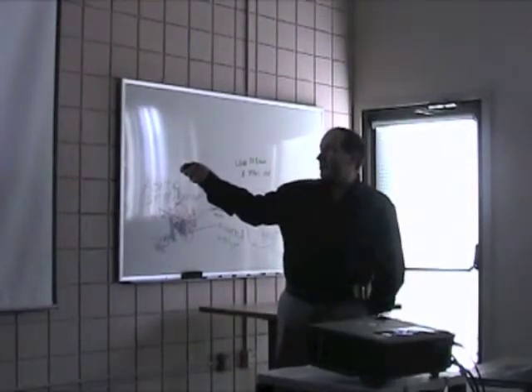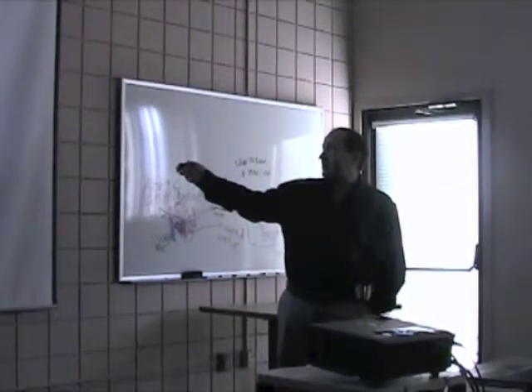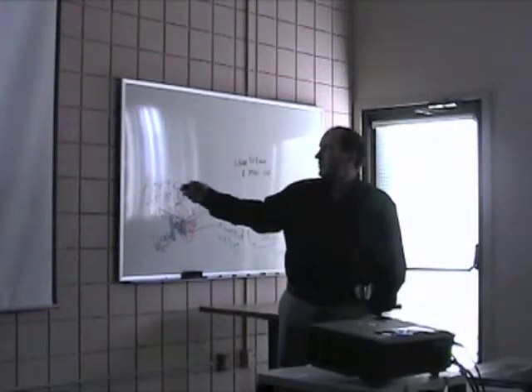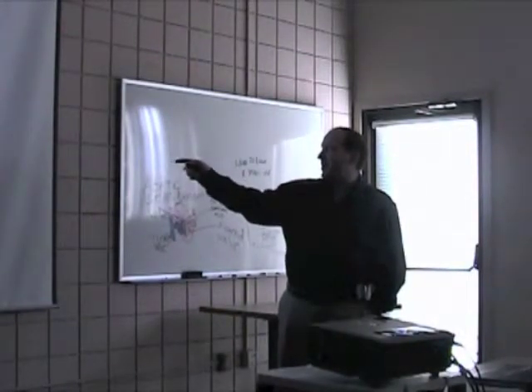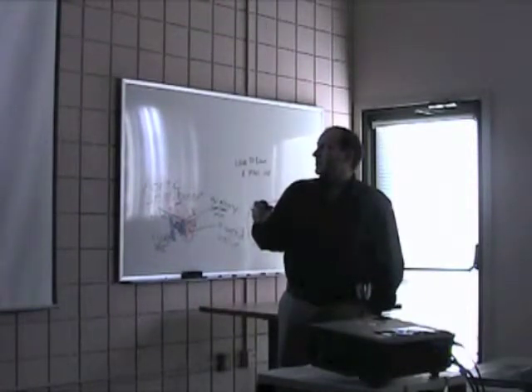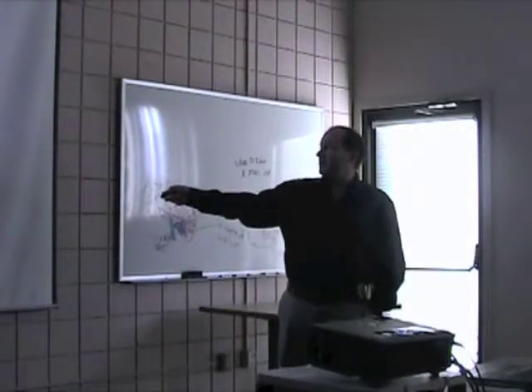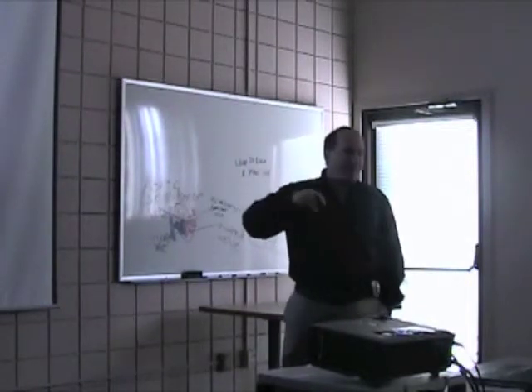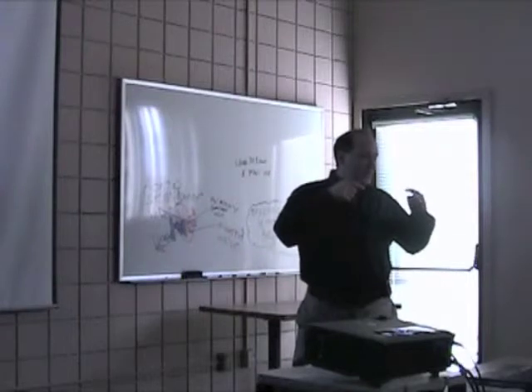So they're not going to cut the valve out, but they're cutting out the aorta, the blood vessel above that. They're going to cut the aorta out and then sew another graft in its place. But the pictures were pretty good. This is one of the coronary arteries that feeds the heart. They're disconnecting that from the aorta so they can cut the aorta out. And then they're going to sew a graft in there and plug the coronary arteries back into the aorta again.